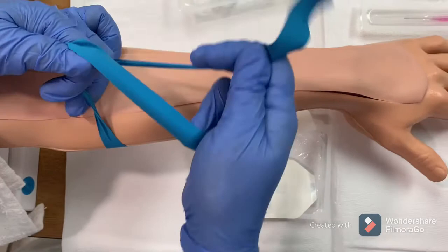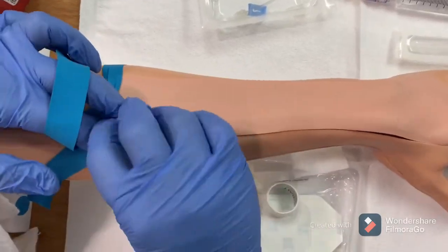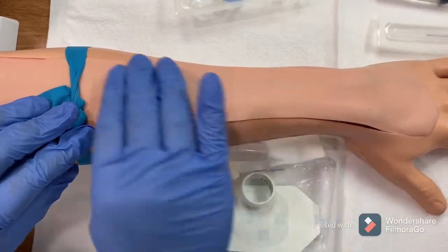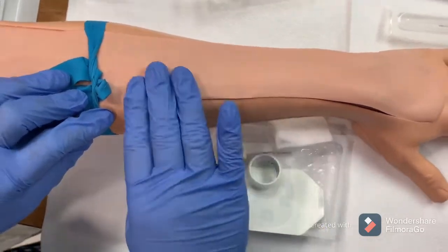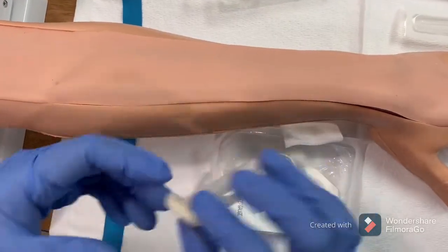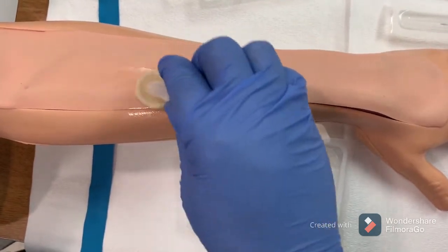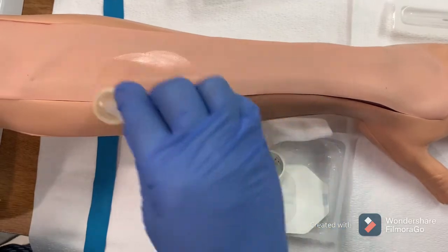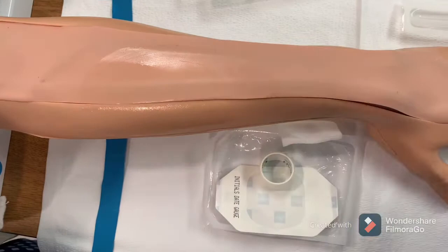The first step of insertion is the application of the tourniquet, which occludes the blood vessel and provides a clear vision of the vein. Palpate the vein with gloves on. Once you feel the vein, tie the tourniquet and clean the area with a chlorhexidine swab for at least 30 seconds in a circular motion.